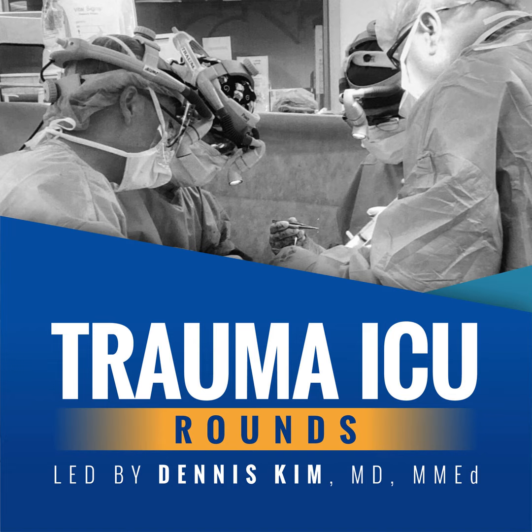But in general, I really am not a fan of this idea of just breathing through this polyvinyl chloride straw, and feel that depending on what type of ventilator you have, either automatic tube compensation and more simply just the application of pressure support really is the way to go when you're assessing someone during a spontaneous breathing trial.